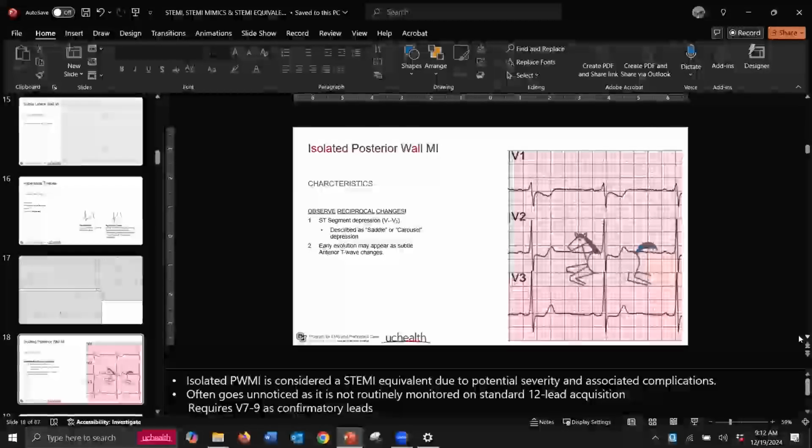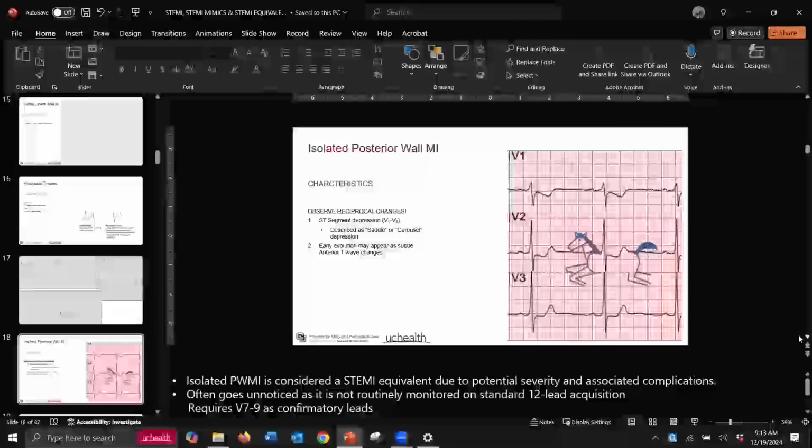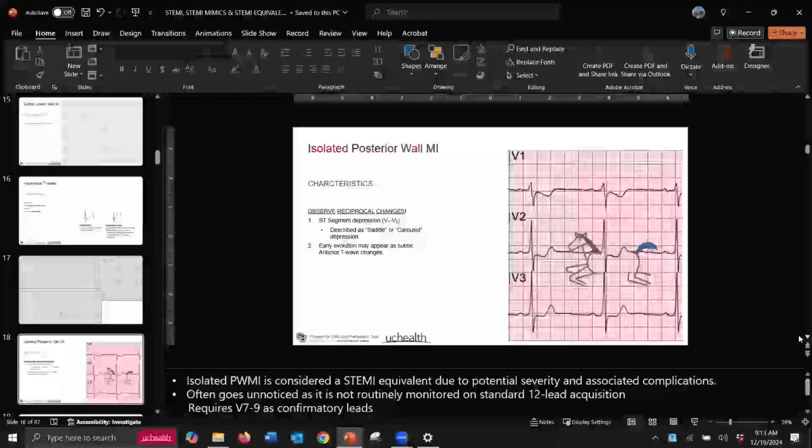So they taught me during paramedic school, and I don't know that it's right, but something that I was taught was the way that your layout is of your normal EKG, translate in the mirror all V leads to the posterior side. Is that true? I've never done it, but essentially, I mean, your 15 leads are still the same.